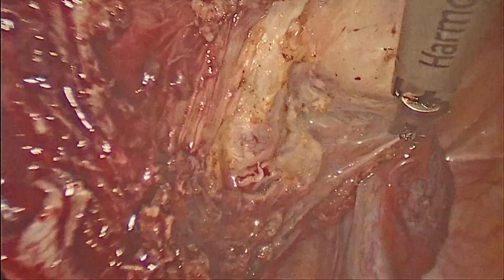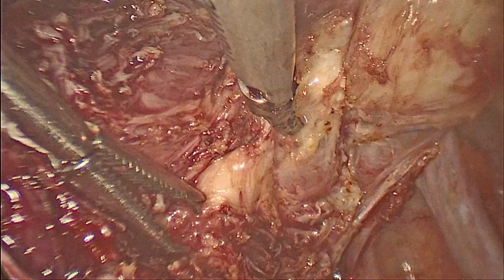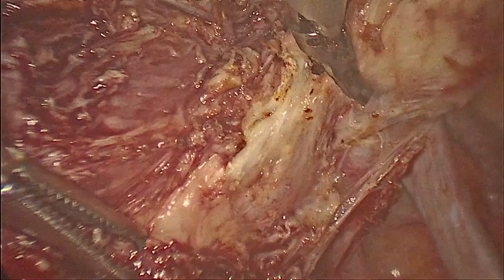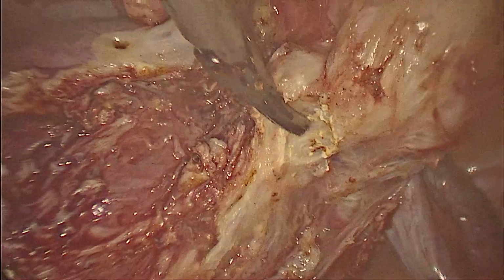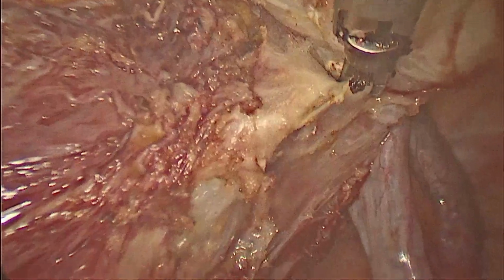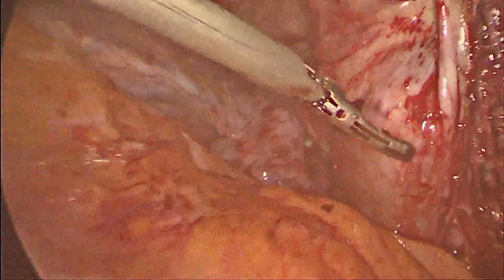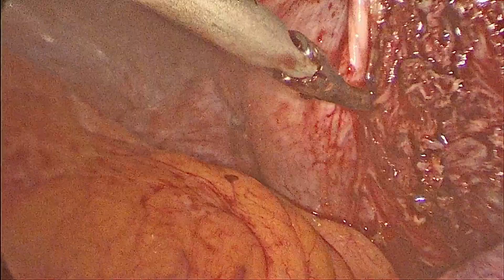In either way, the dissection should be meticulous, slow, and under vision, where the harmonic scalpel has a major advantage. It can be done with cold scissors or even unipolar, but their energy use will be more. There will be lateral spread, and more scarring of the tissue.